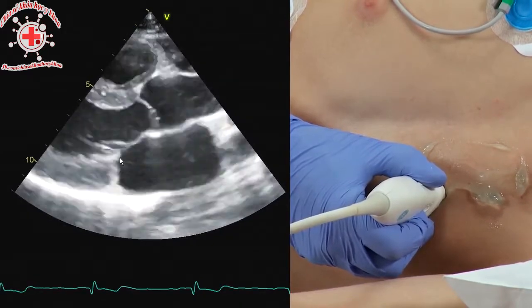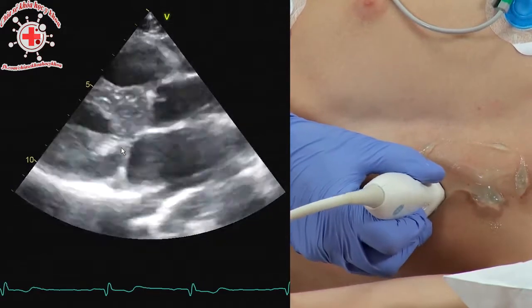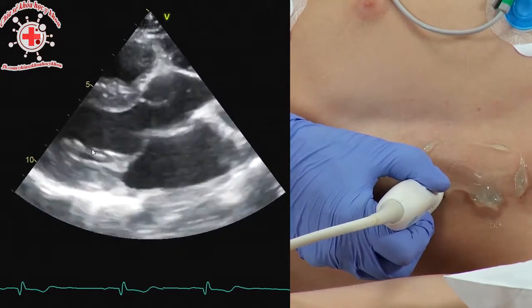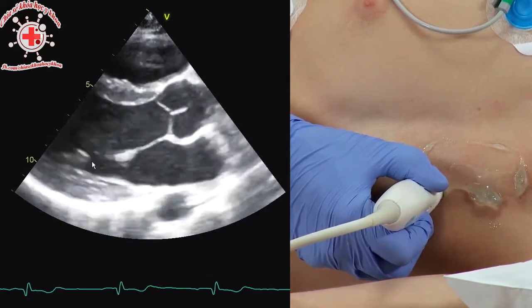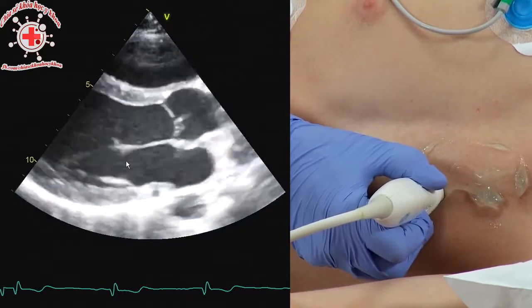Look what happens if I move the transducer back and forth a little bit. I tilt the transducer now more cranially or more caudally, and what you will nicely see is the papillary muscle and the chordae as they insert into the mitral valve. So a wonderful way of scanning the mitral valve. We'll talk about that in the chapter on mitral valve pathologies.